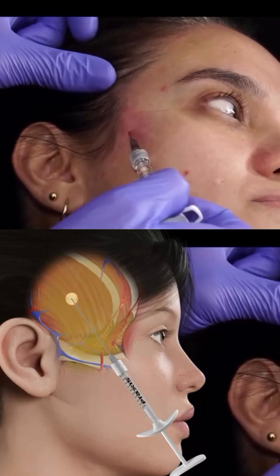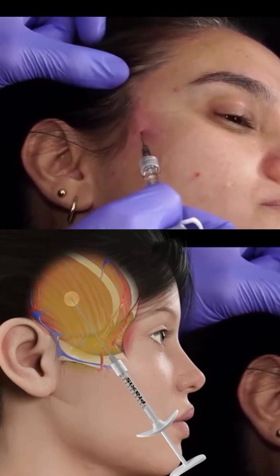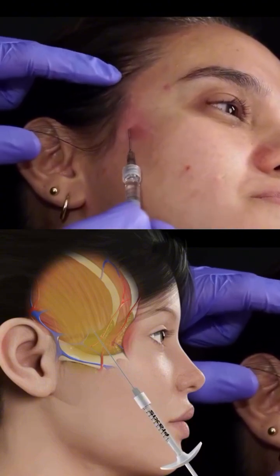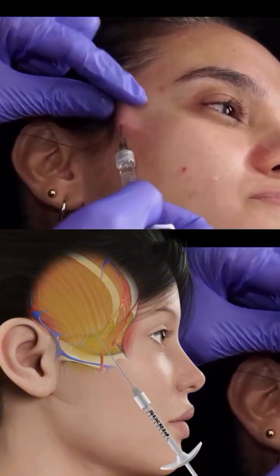The characteristic of this injection is that the patient will feel this product here a little bit, but it serves precisely to create a lifting effect. So let's get started.